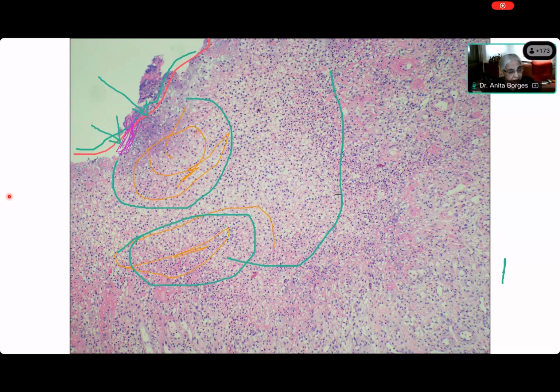All right, let's ask somebody else. Who's there? Aditi, show me the base of the ulcer. Ma'am, send the request for annotation. Come on. Ma'am, this. Where is it? Acha, you're doing a lot. I know. She did it here, but you did it with the disappearing pen. Let's use the second pen. Ma'am, only getting 1 pen option. No, there are 2 pens. There is one, the second one. Yes, ma'am. I'm doing one with this.